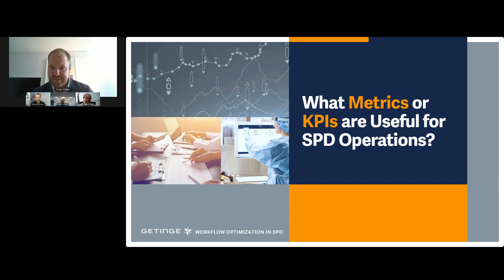There are so many different points that you can measure. From the time it hits decontam to the time it hits the sterilizer, from the time it hits decontam to the time it hits the washer. There are so many data points that you can measure and have that continuous process improvement with the addition of that management engineering team or performance services. So don't think you have to do it alone. There are people in your facility that can help you.